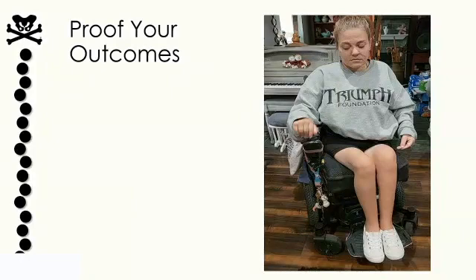Okay, great. Then we're going to proof the outcome. Again, my mentors have ingrained in me the posture and postural tendencies, and we're always going to look at rest as the primary goal. So we want them to rest into good alignment. Next, we're going to look at maintaining for fine motor tasks. And last but not least, we don't want to block any gross motor tasks.